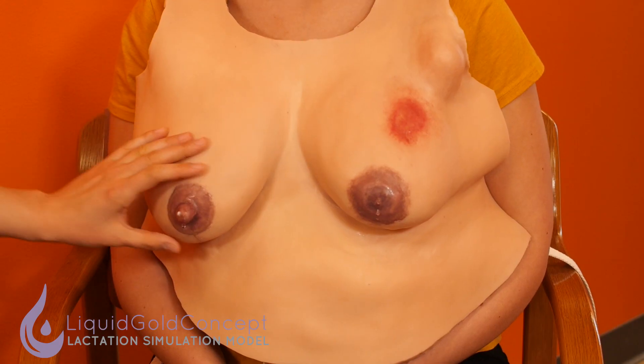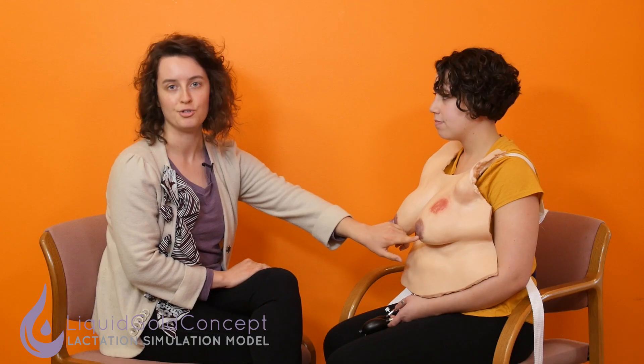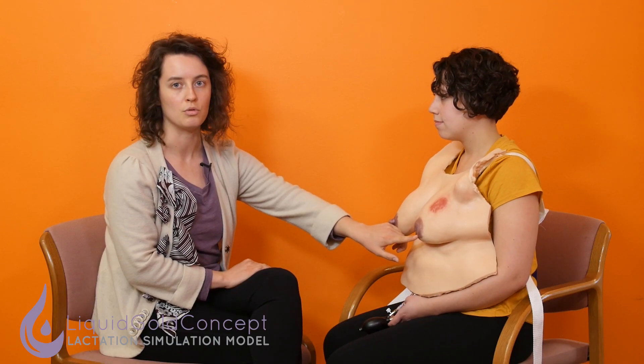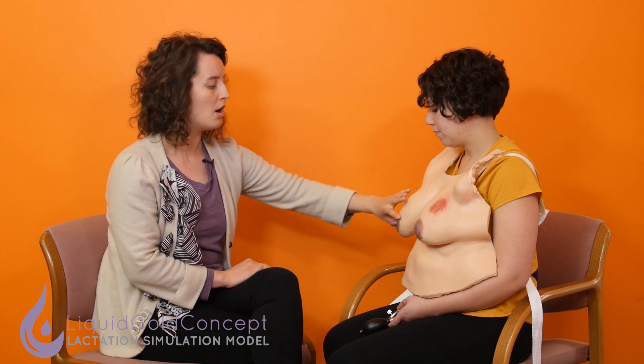Here we have Sam again wearing our Advanced LSM in the light B color. You can notice immediately that the nipples are very different from the Essential. On the left we have a flat or inverted nipple — it's up to you to choose your own adventure with the case and how you want your learners to discuss inverted or flat nipple management. On the right we have a bulbous or elongated nipple, which is great for talking through what to do with a preemie baby with a very small mouth who may not be getting a deep latch. On the bulbous nipple you'll also notice we have a milk bleb — a fairly common condition that many moms will experience — great for practitioners learning to counsel moms on nipple pathologies.